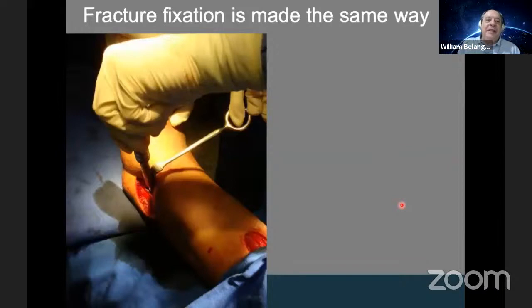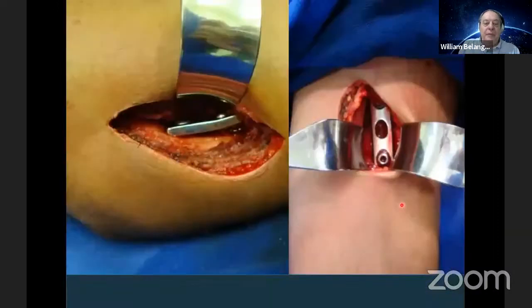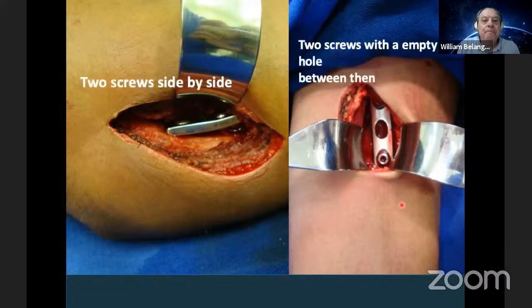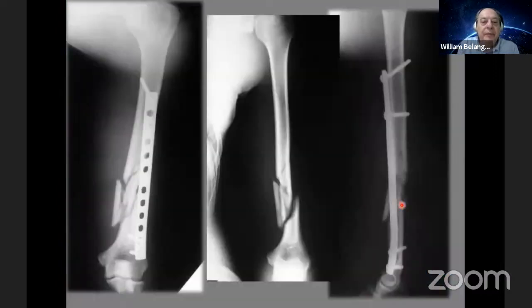The fracture fixation is made the same way. You start with the more distal screw, then you align the bone, the fracture, and then you put the more proximal screw. Then you fix in distal using side-by-side screws, and in the proximal, you leave an empty hole, okay? Then you can check your clinical alignment.